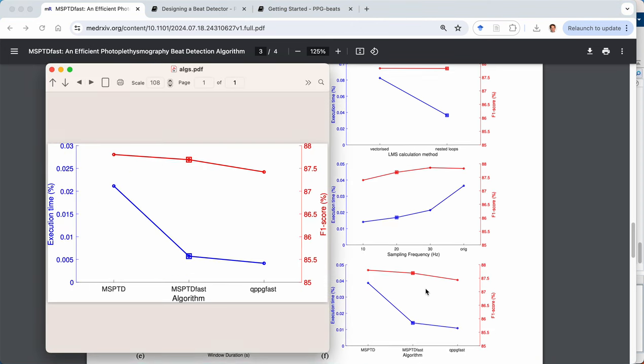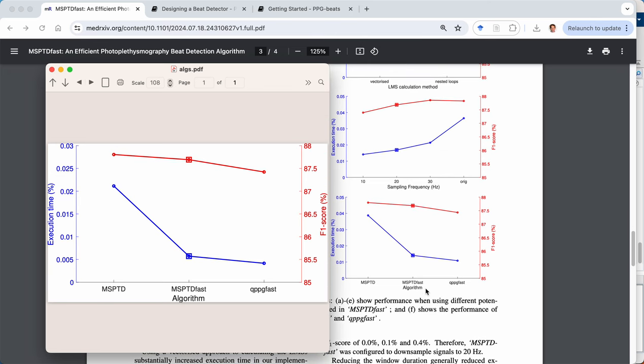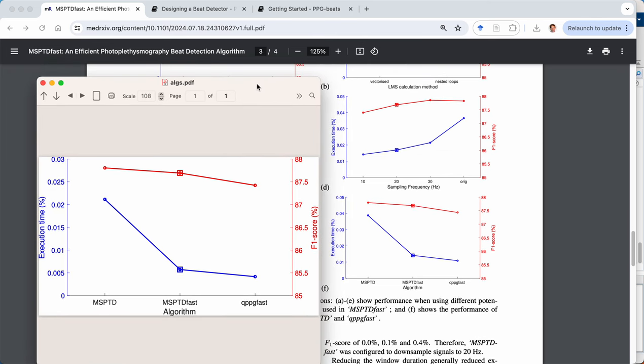And hopefully we find that the other plots also look similar to that reported in the paper. So for instance, this perhaps the most important plot of all shows the performance of the original MSPTD algorithm on the left, the fast version, which is the one incorporating all of our chosen options for each of the configurations. And then QPPG fast, the comparator algorithm that we're comparing against.